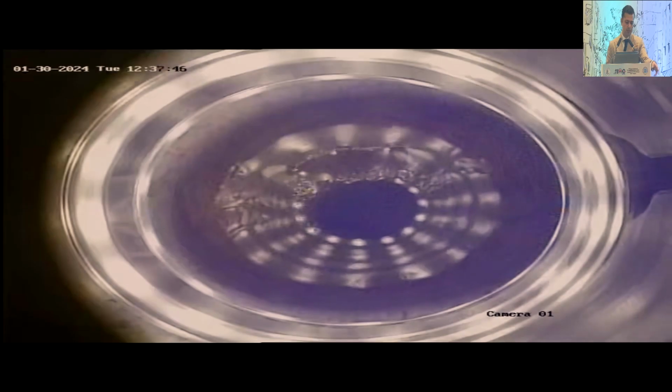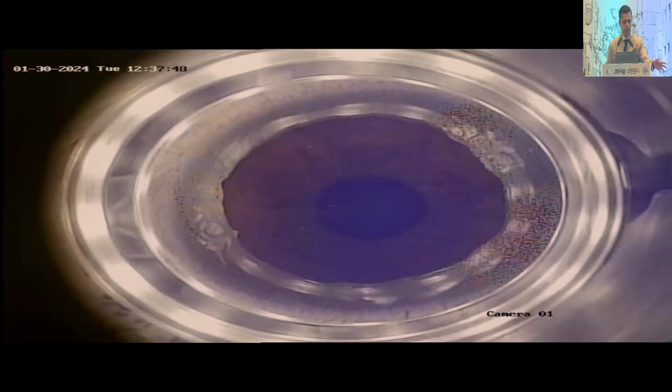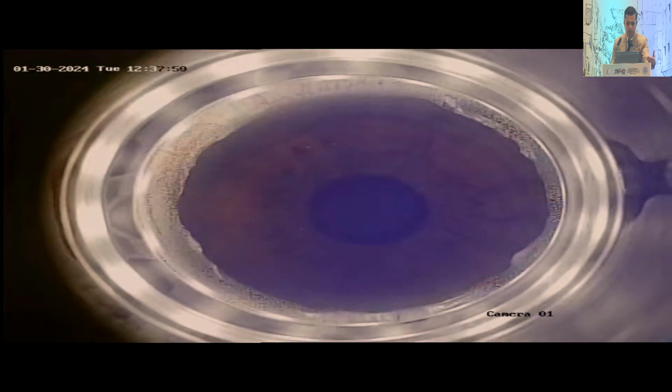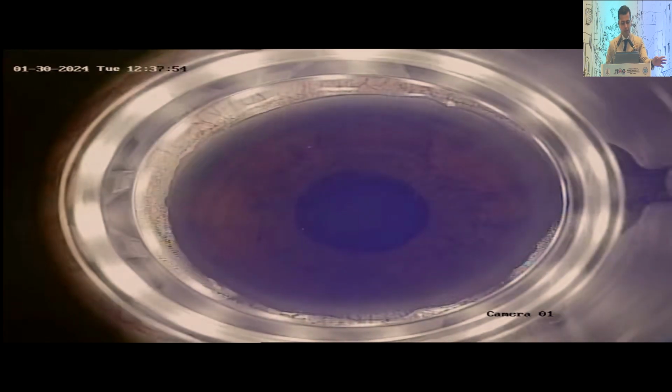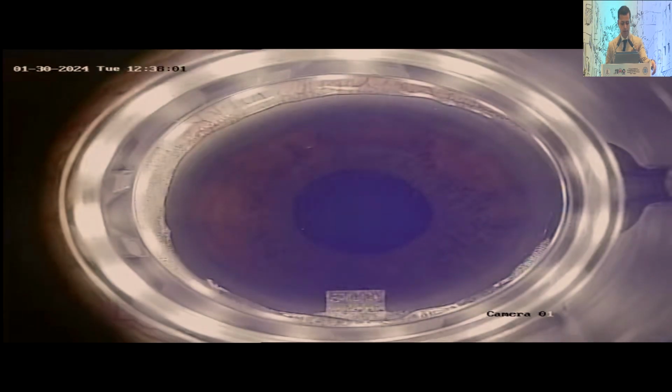Again, this is just to show you, despite all workup and everything, one patient that I would have done ICL for is this patient, and I wanted to show you this because this was an absolutely normal pre-op workup, and you can imagine the amount of diagnostics that we're doing. Generally, nothing would go missed. This patient had a very good straight docking, and notice when the laser fires, I'm making a 110 micron flap on a femtosecond platform in an absolutely normal eye.